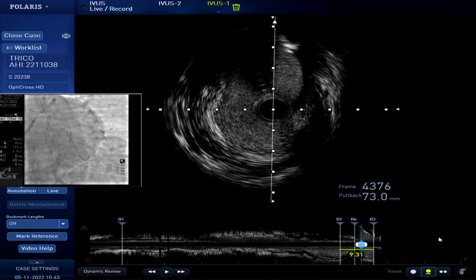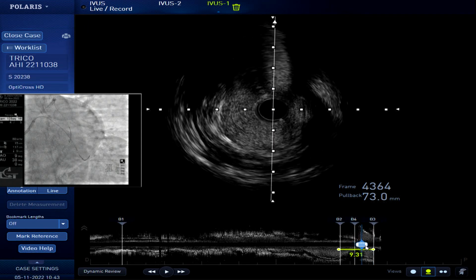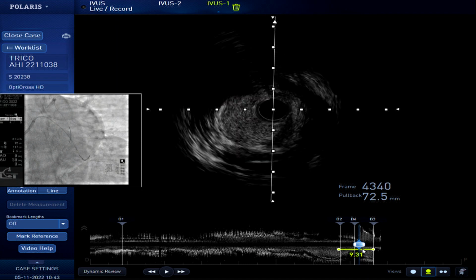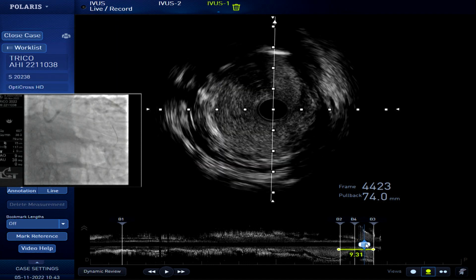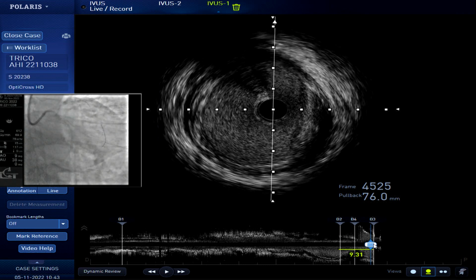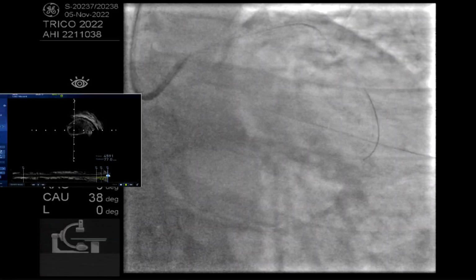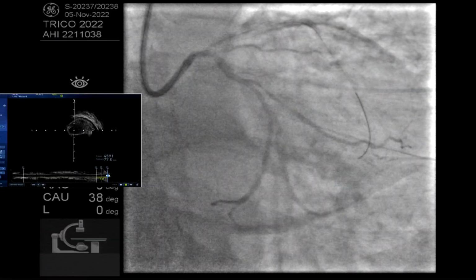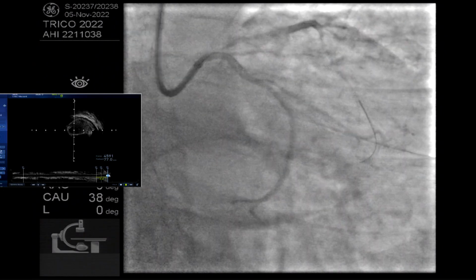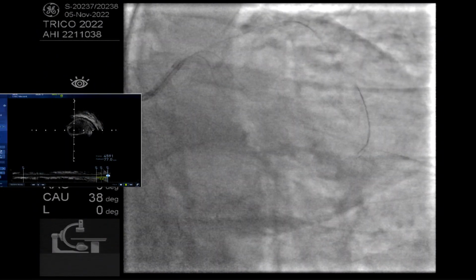The angle is, the carina angle might be more than 50 degree, and from the tip to the branch start might be more than 10 millimeter, I think. Try to check. So we cannot speculate any carina shift to the compromised result, right? So that is the IVUS findings.